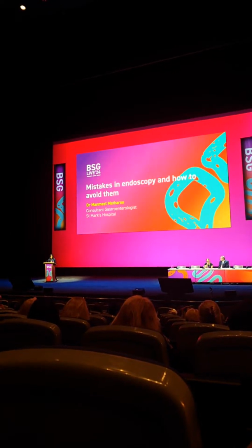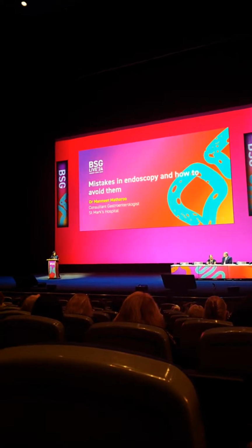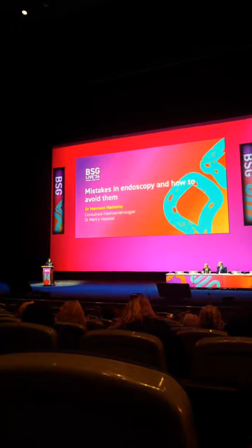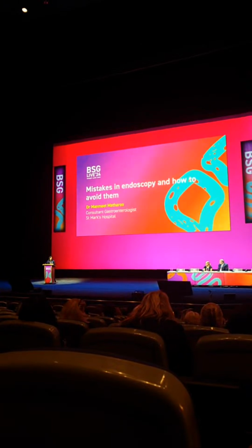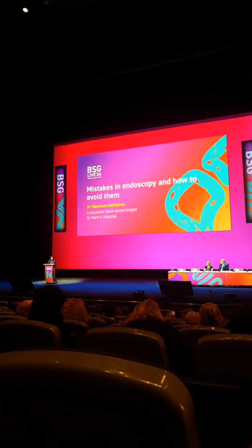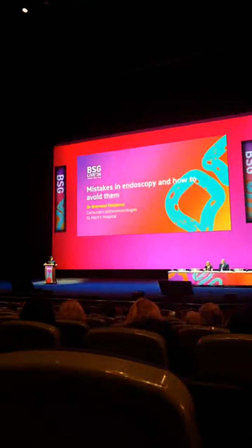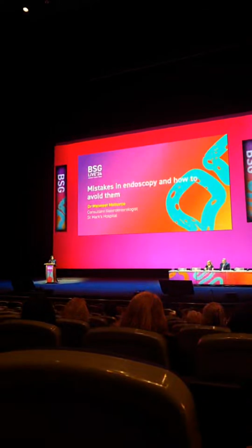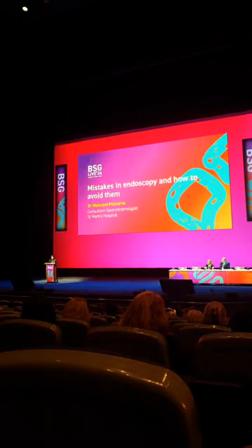You can do a good team briefing within 5 to 10 minutes if you have the relevant clinical information. If you don't have the clinical information, then it takes longer, but then I would argue that you need to take that time because it's going to prevent errors down the line. But I think this is a constant thing between being efficient and having high quality, and we shouldn't see the two as mutually exclusive. Doing the briefing might take a bit more time and add on to a list, but it's certainly going to save you time when you avoid a patient that didn't need an endoscopy. That's going to take a lot longer doing a serious incident investigation.